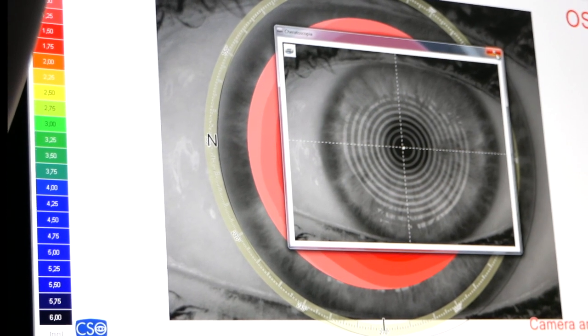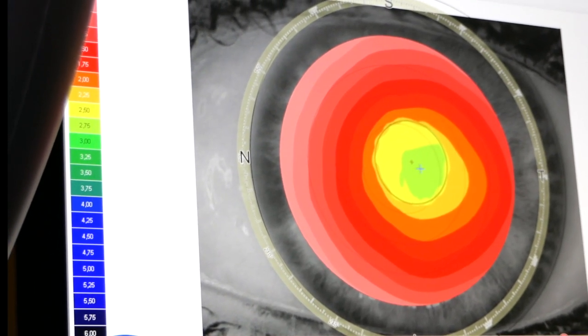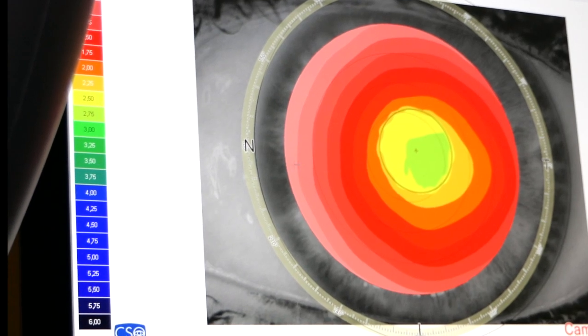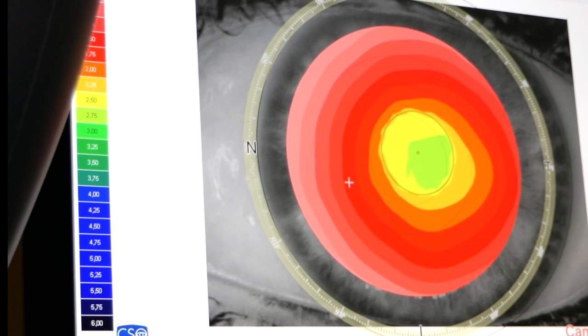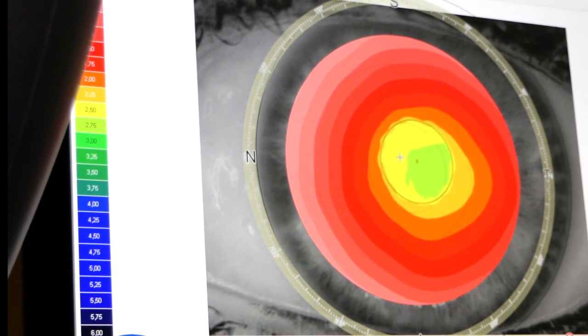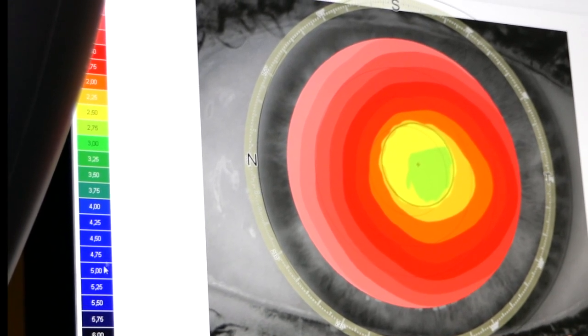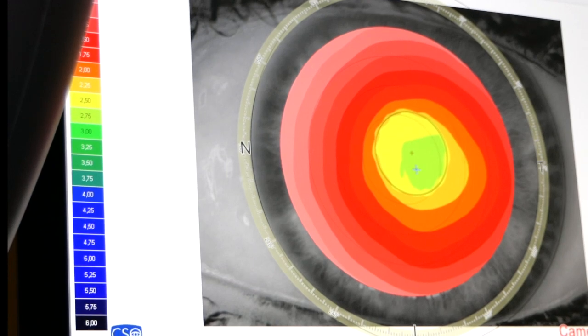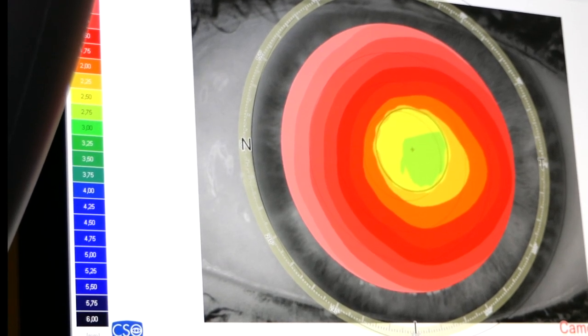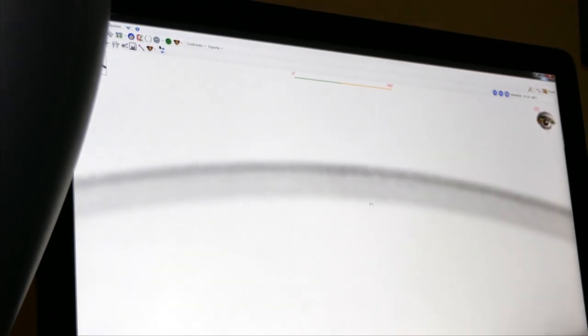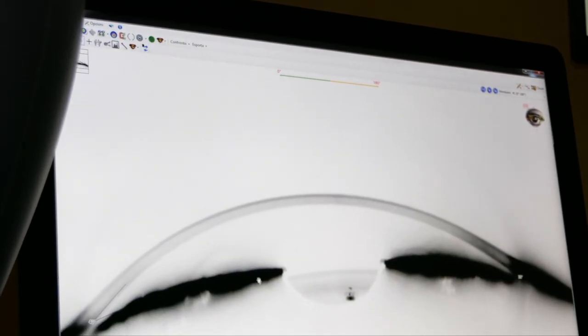The topographer also allows us to see the anterior chamber. Behind the cornea, which is transparent, there is the iris and then the crystalline lens. Since the cornea is transparent, the topographer manages to measure the space that divides the cornea from the crystalline iris plane. This space is represented in millimeters.